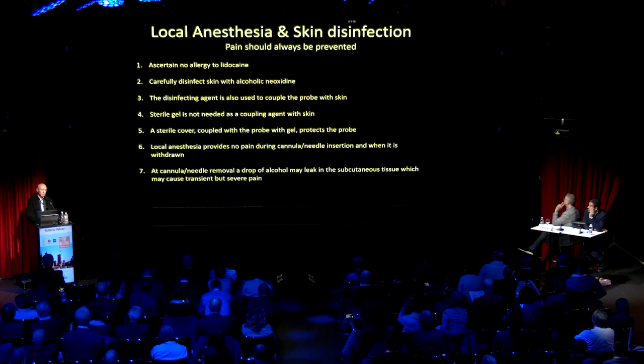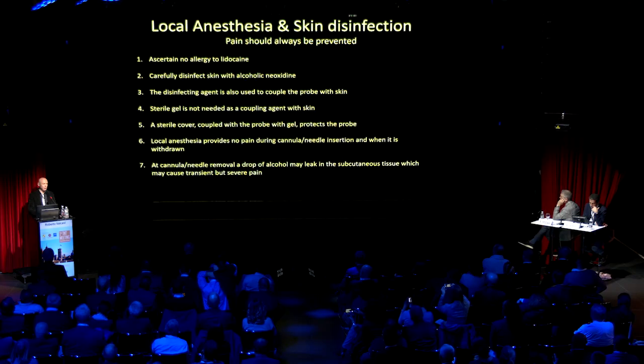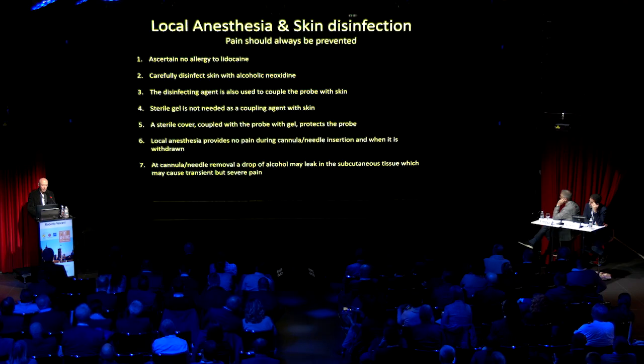And this is the checklist that I use before doing ethanol ablation. First, ascertain no allergy to lidocaine, and carefully disinfect skin with alcoholic chlorhexidine.